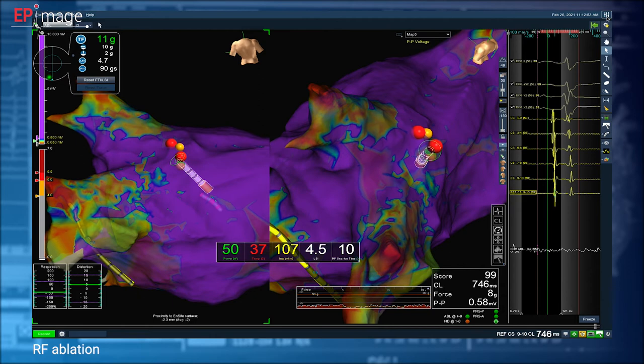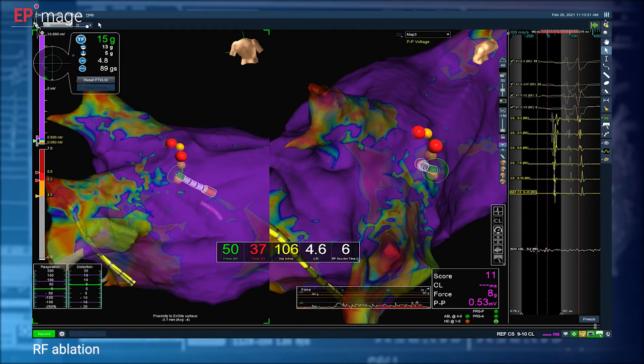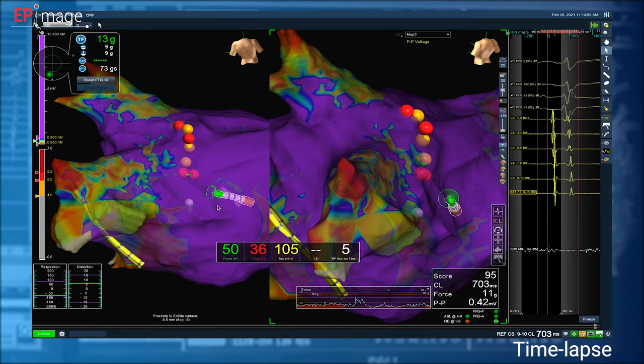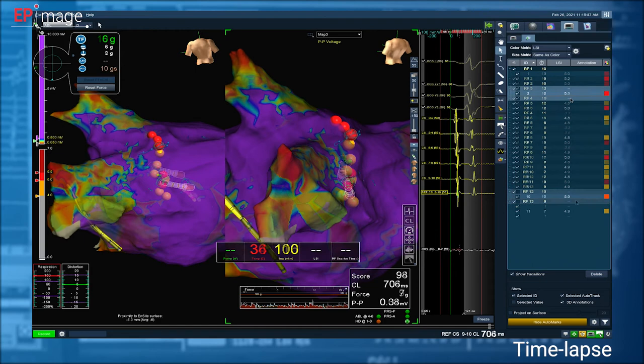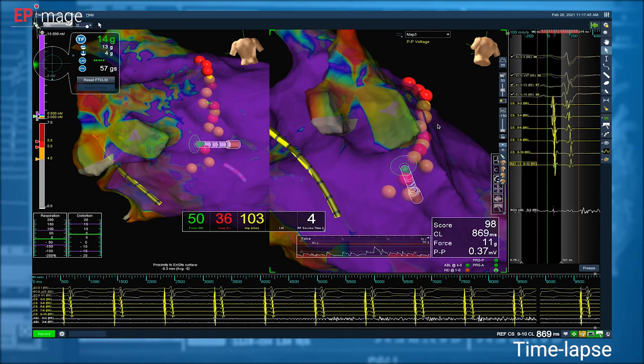Our settings on the radio frequency generator are 45 degrees centigrade and 50 watts. So we'll be ablating with 50 watts in all parts of the left atrium, on the posterior wall and in other regions. The idea of ablating with 50 watts is that we will have shallow but wider lesions as compared to standard 20, 30, 35 watts.